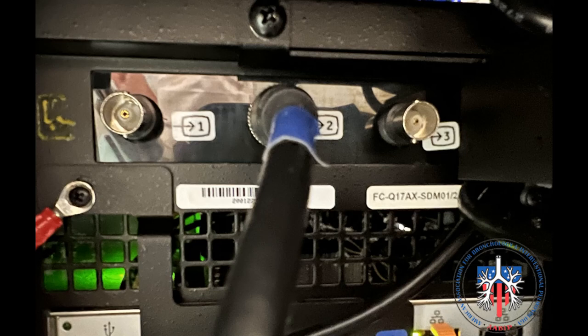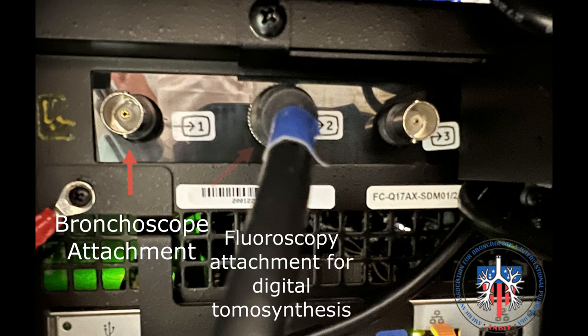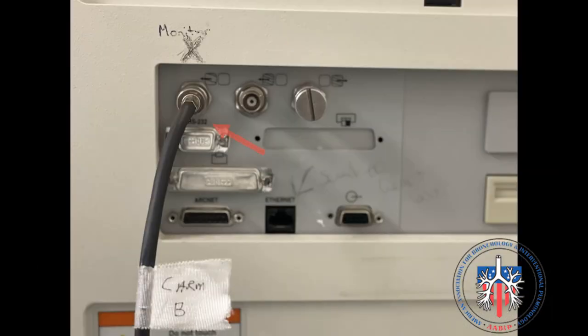On the back of the tower, there are three cable attachments that will allow images to appear on the tower: first, the bronchoscope white light attachment; second, the fluoroscopy attachment, which is necessary for digital tomosynthesis; and there is a radial endobronchial ultrasound attachment to allow images to appear on the tower. This is where the fluoroscopy cable is attached to the GE 9800 C-arm monitor.